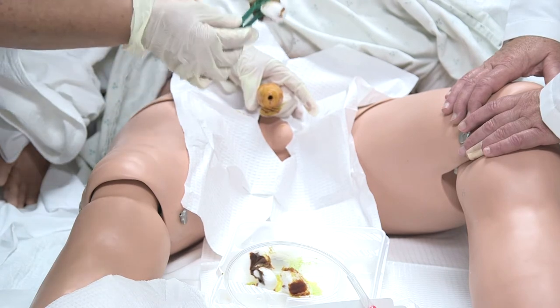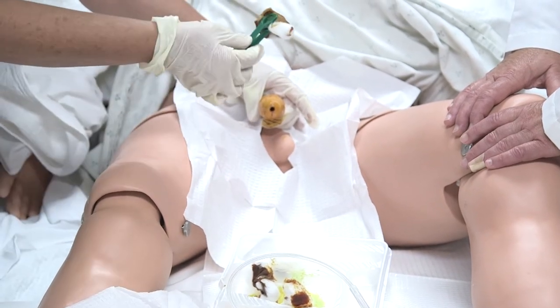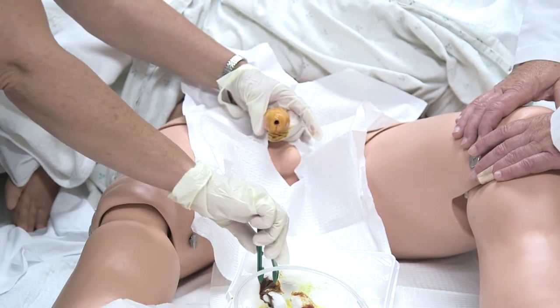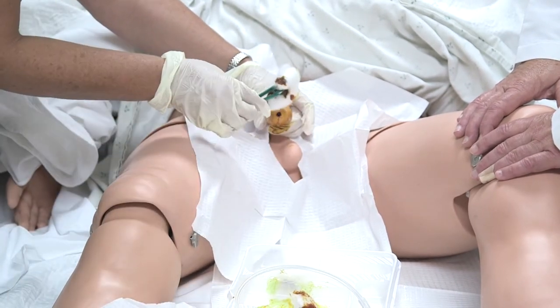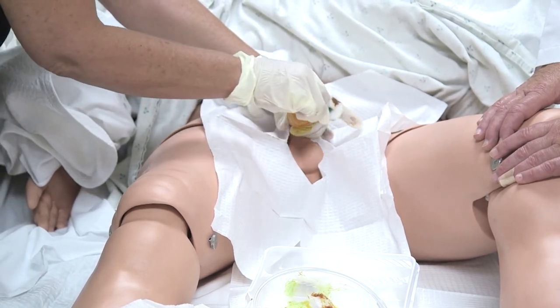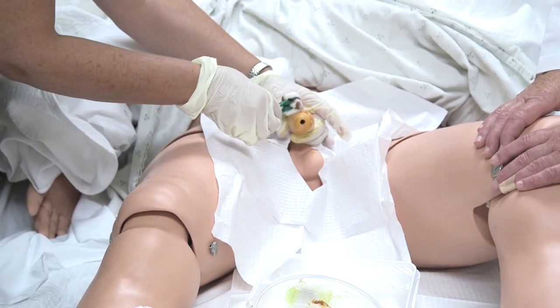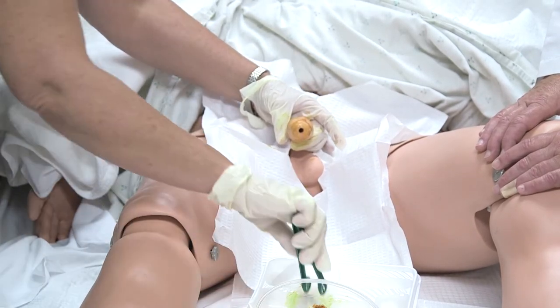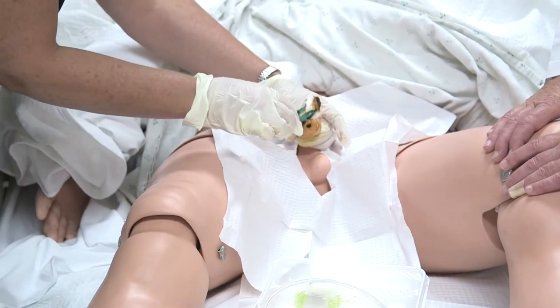This is important. You do not want to go over your sterile field. You want to keep your arm away from the sterile field. You don't want to cross over your sterile field. So we're going to do this again, same motion. And this isn't a real patient, so it's kind of hard to do this, but you could even go farther down with your cleaning if you wanted to. All right, and then we're going to do one more.